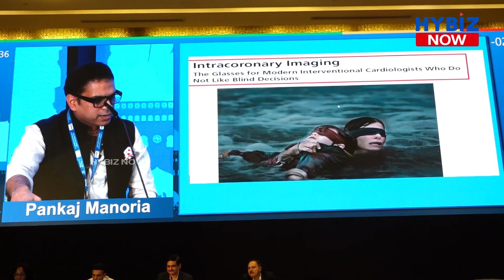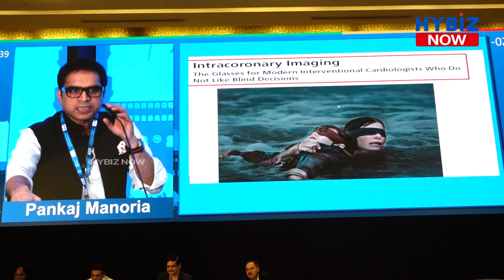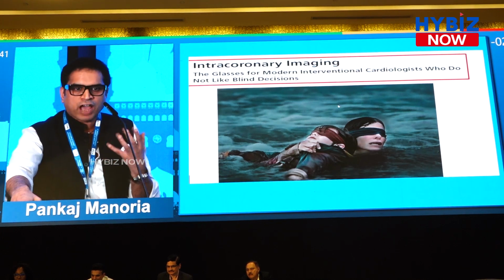I think IVUS is like the glasses of modern day interventional cardiologists who do not like to make blind decisions.